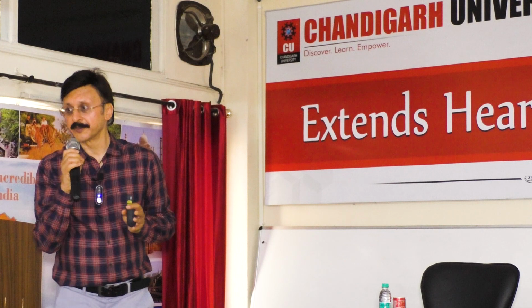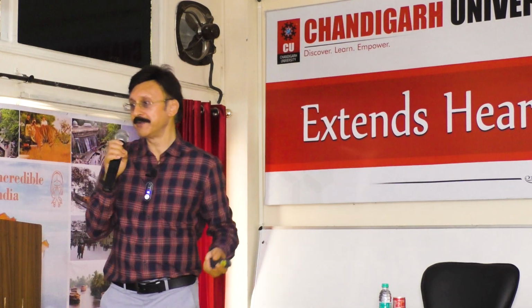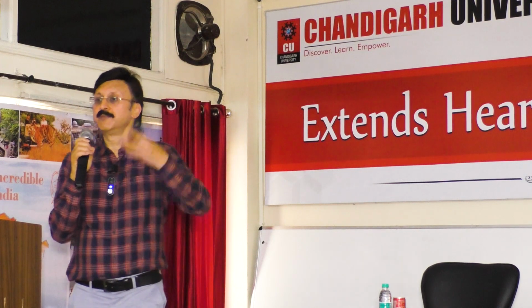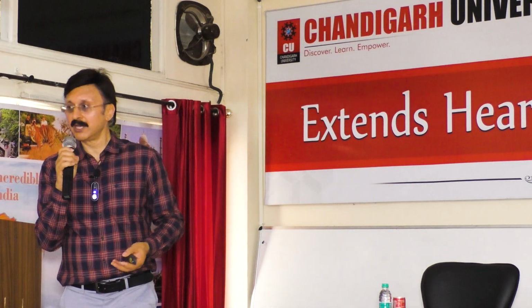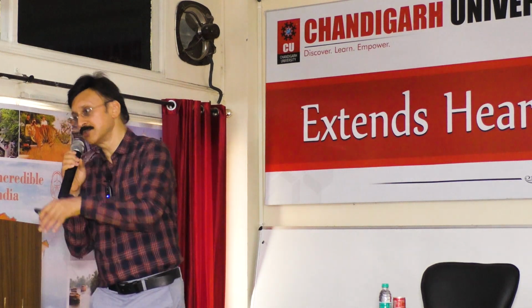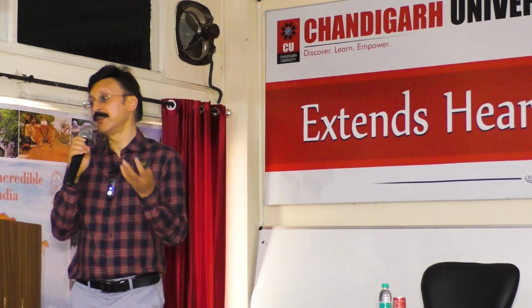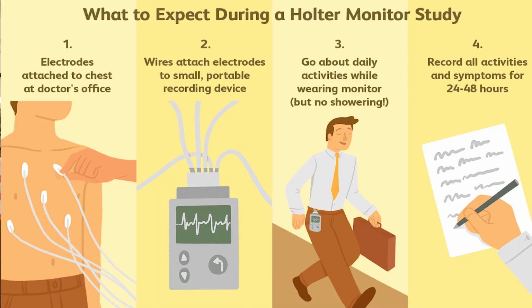Because when the patient comes to us, at that time there may not be any change in the ECG, but maybe after an hour, or maybe after 12 hours, maybe after 24 hours, the patient may be having some change. But when he comes to the hospital, by that time the change may have settled, so we will not be able to find out what is going on. So for that we can use the Holter.